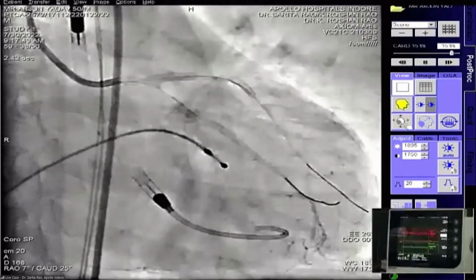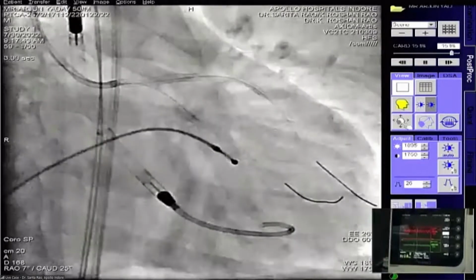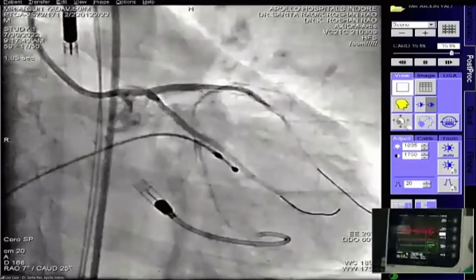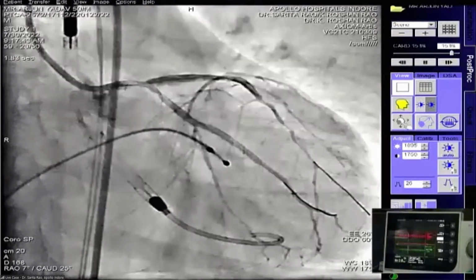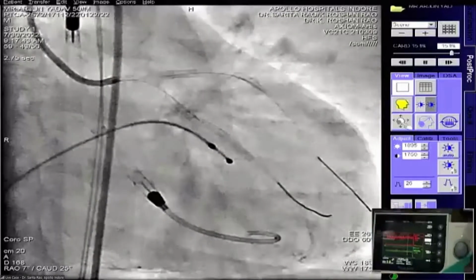I think you need to do a POT. Yeah, I think the left main area still looks a little less. Madam, what I suggest is, because we overlap in the two centers, probably you'll do the POT and optimize the result there. We'll go briefly to the other center, and after 20 minutes we'll come back to you so that we can see the rest of the work.